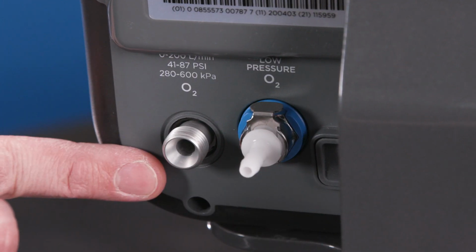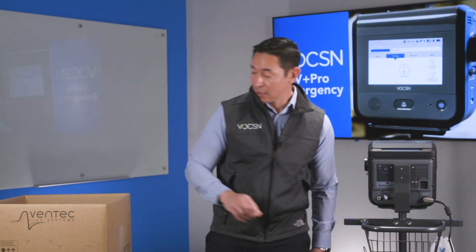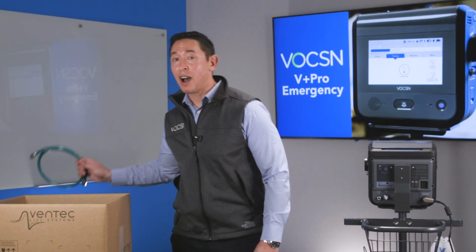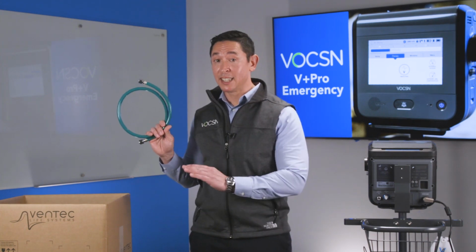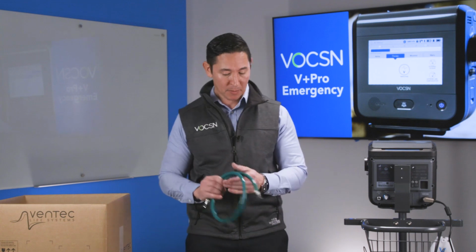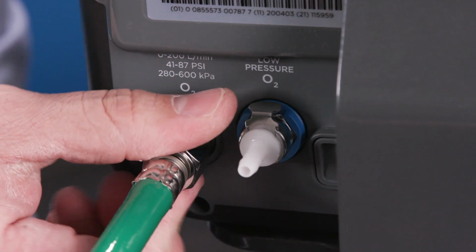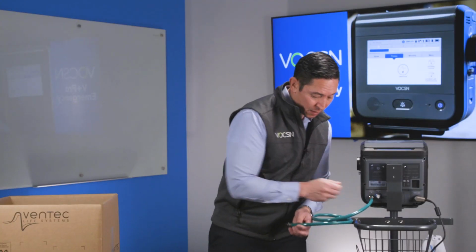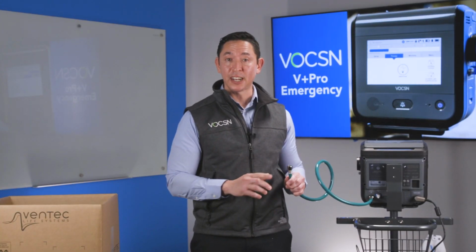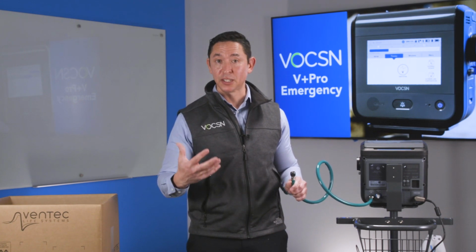The next port I'd like to point out is my 50 PSI high pressure oxygen port. So I happen to have a piece of oxygen tubing right here. It does not come inside the box, so follow your facility's protocol for where you're going to get one of these. So I'm just going to thread it into place. Now you'll take the other end of this and just connect it to your E-cylinder, your H-tank, or your wall source, whatever 50 PSI source you have available.